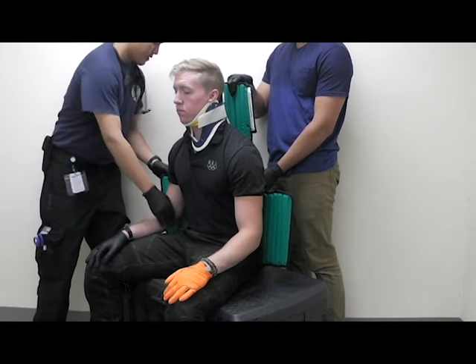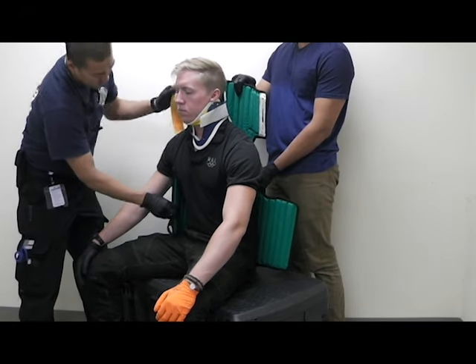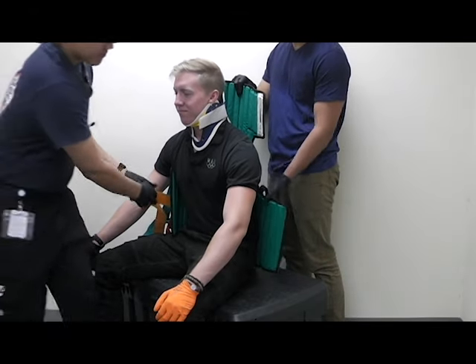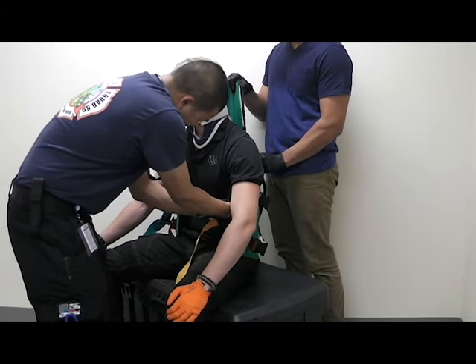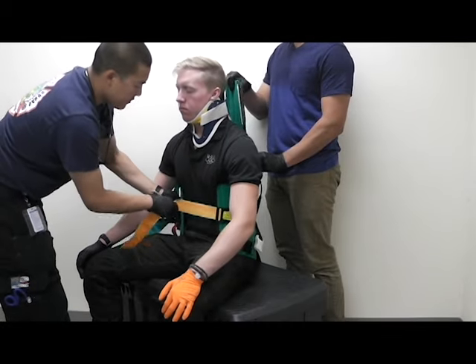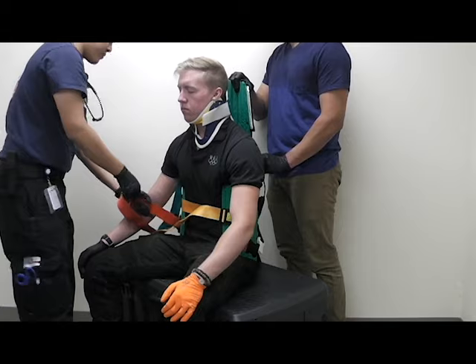So the middle strap — bring it around the patient. The middle strap in this case is going to be the orange one, or yellow, whatever you think it is. Once you place that, you're then going to tighten it down. Keep in mind not to tighten too much — make sure the patient is comfortable when you put this on.